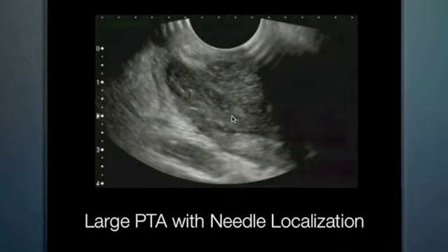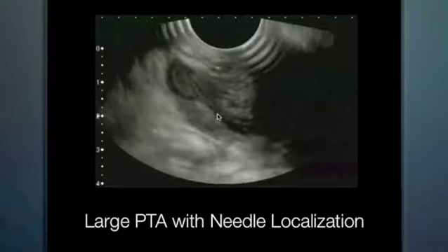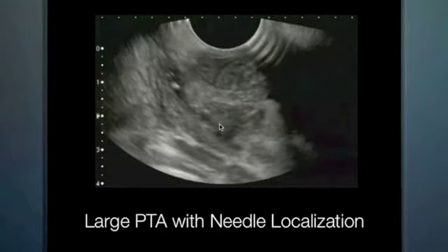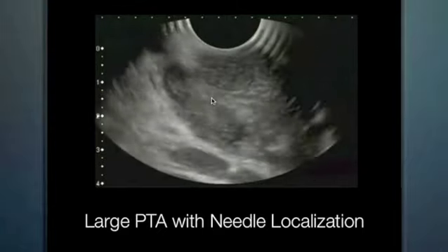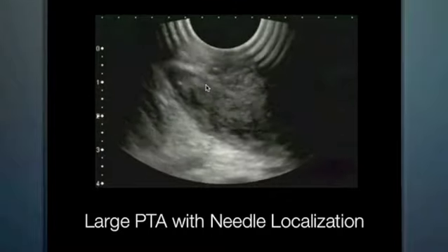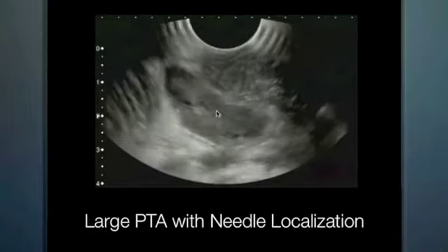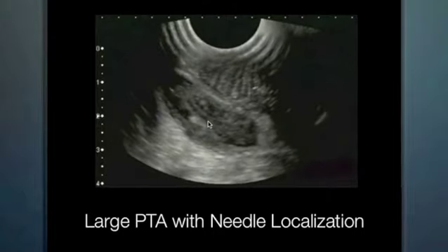and this very severe degree of a peritonsillar abscess. You may find that some of these are so large that they're very easy to drain, or that they're so extensive that they may need to be drained in the operating room for maximum comfort and securing of the airway. However, ultrasound does help to differentiate how difficult or easy a drainage procedure could be. And we can localize the needle.